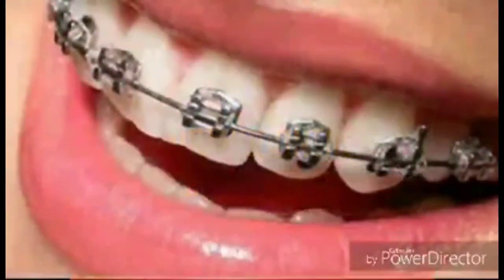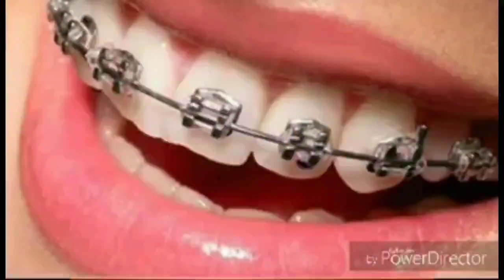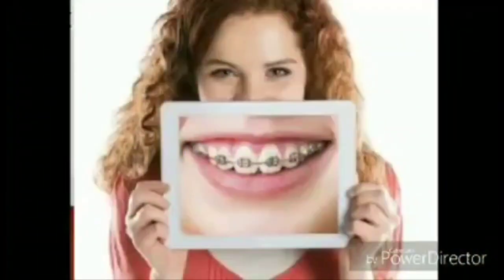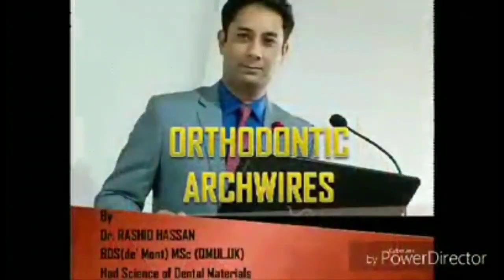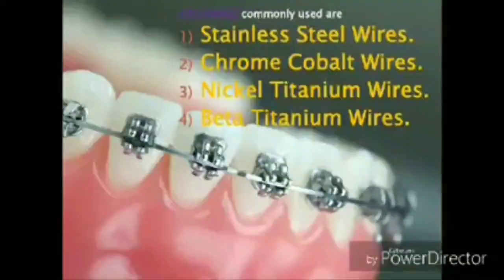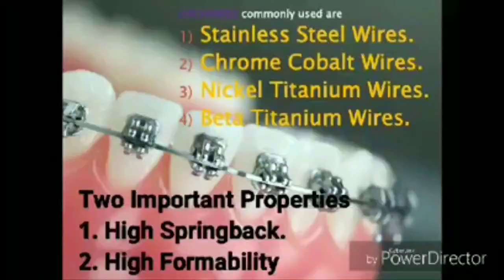A majority of orthodontic treatment is done with the fixed appliances, which mainly comprise of brackets, archwires and ligatures. This lecture deals with few of the alloys which are most commonly used as an archwire in orthodontic treatments. Four types of archwires are most commonly used in orthodontic treatments.